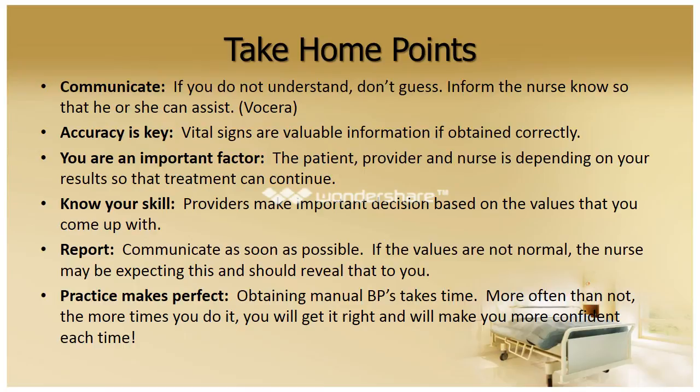Making sure that you're obtaining accurate results is very important. The doctors are making decisions based on these values, so it's important to be sure that you have the right information. Again, if the nurse is expecting the vital signs to be abnormal, this would be important information for you to know.